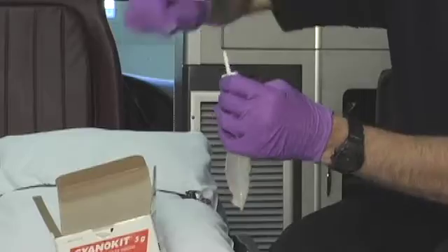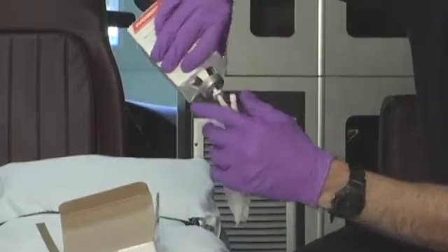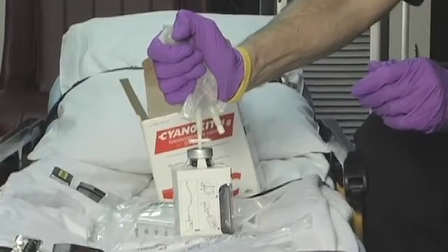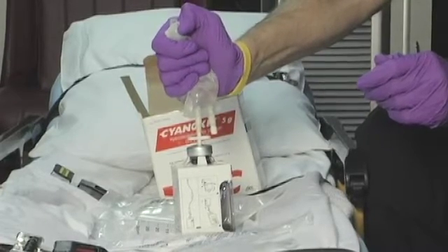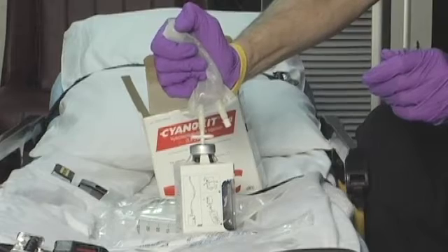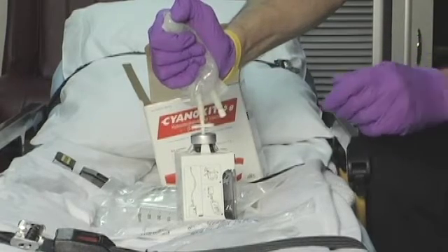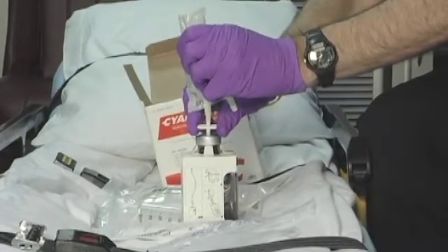We'll spike the bag, then spike the bottle, similar to spiking with an IV solution. Put the bag upwards and squeeze the 100 cc's of diluent into the bottle — you'll probably have to release it once or twice to get the air out. You'll notice the mixture coming back into the bag is reddish colored. The powder inside is red, and a side effect of the medication is turning the patient's skin red, urine red, most of the patient red, lasting five to seven days.